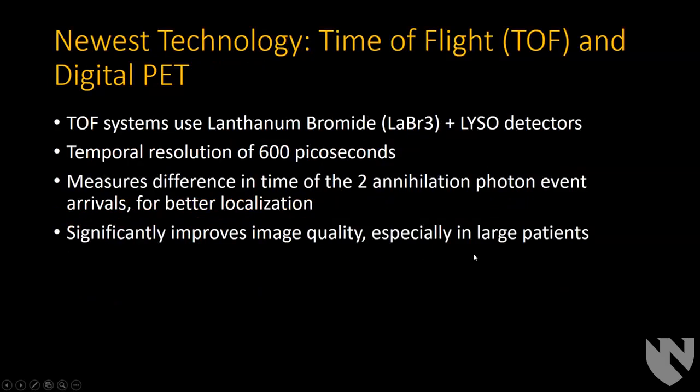One of the newer PET technologies, which our new scanner has, is time of flight PET, and also digital PET. This uses a lanthanum bromide or a LYSO detector, which is again a lutetium-based detector.